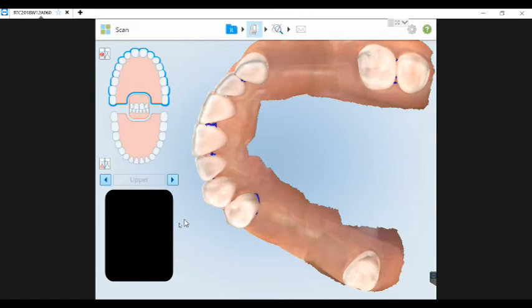I know once we go digital, we want to keep everything digital, and usually we can. So think of that 80-20 rule. If you're able to do 80% of your dentistry without resorting back to PVS, you're doing a fabulous job. And as I mentioned earlier, you're going to continue to see the evolution of the software really improve dramatically, I think, over this next 6 to 9 months when it comes to edentulous scanning.